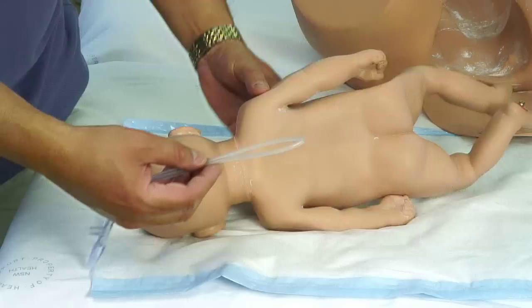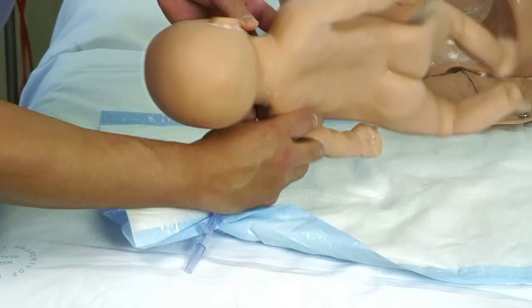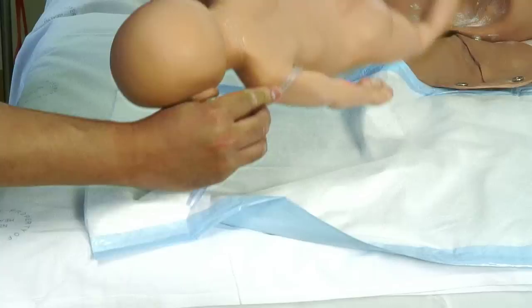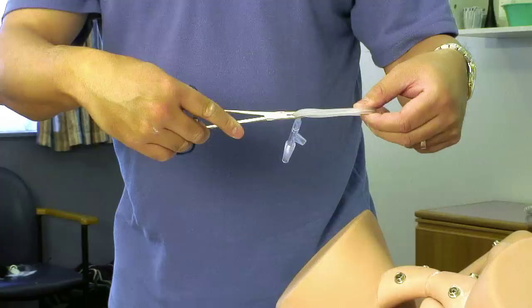I'm going to demonstrate on this model, without using a pelvis, how we apply the sling. Forming a loop with a plastic feeding or nasogastric tube, we push the loop into the axilla posterior to anteriorly, and then with the finger of the left hand we hook around the tube. That gives us a loop of tube that we can apply traction to in order to deliver the posterior shoulder. A clamp such as a Harrison Cripps can also be used to take hold of the tubes and pull the posterior shoulder.